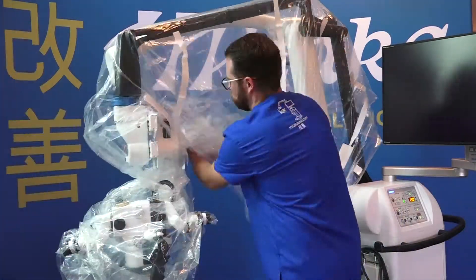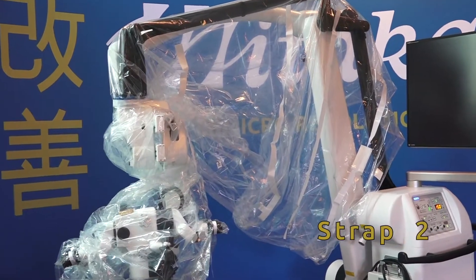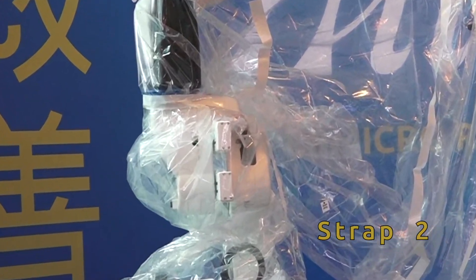The main goal for the placement of strap 2 is to place it securely around the blue metal ring. This will improve the movement of the scope once draped.